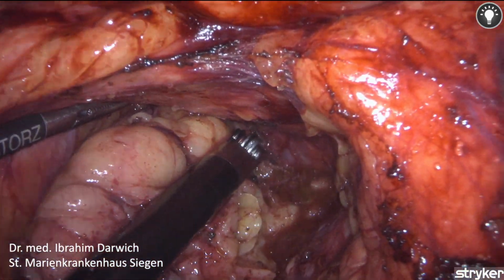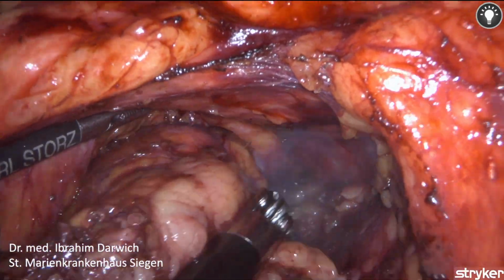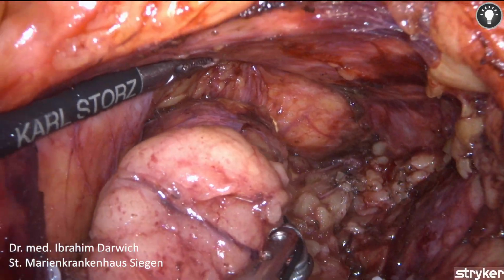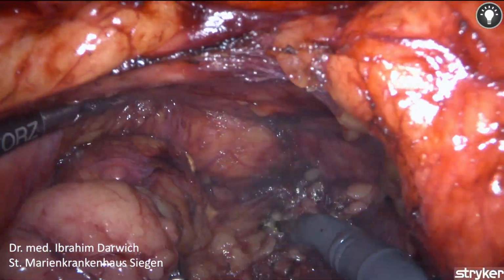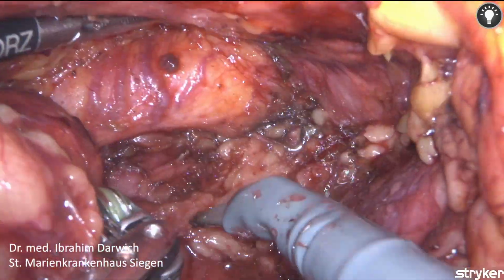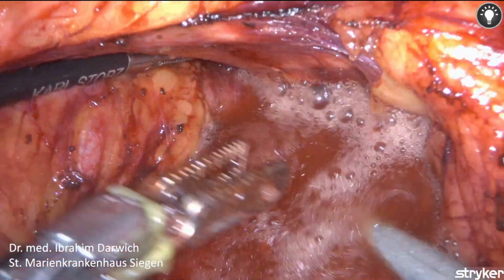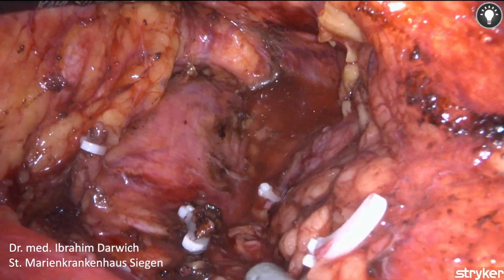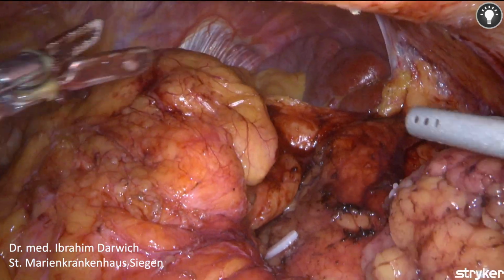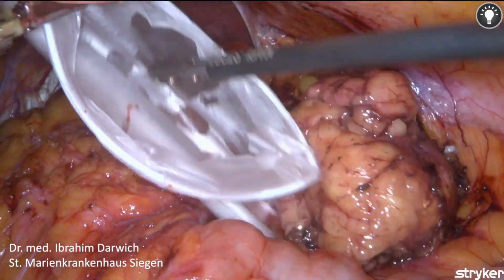The last attachments are dissected until the entire gland is detached. The specimen is retrieved through the camera port.